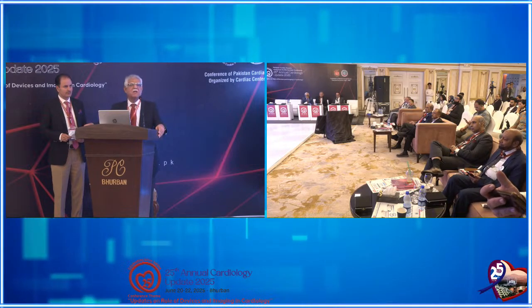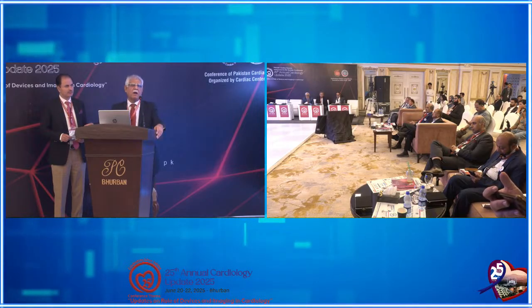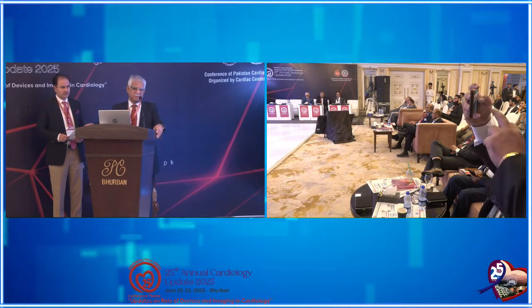Obviously the information would be limited. If there's a lot of calcium, the information provided would be less accurate, and the coronary stenosis would be overestimated.